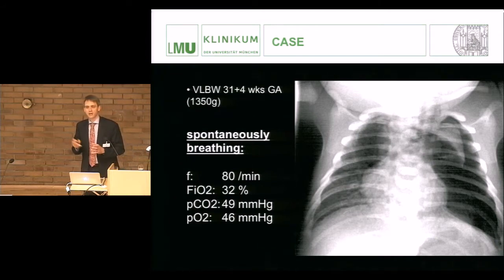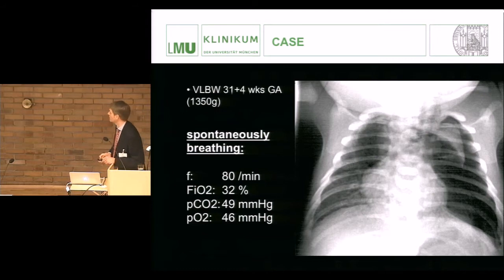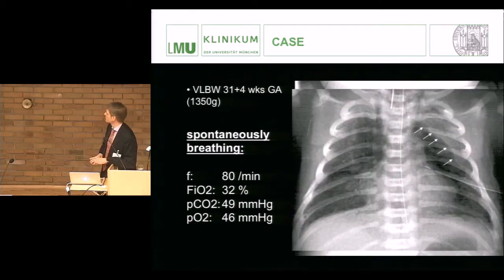So on the one hand, there was the differential diagnosis to have a pneumothorax on the left side. However, if you really look at it very thoroughly, there's no sign of tension pneumothorax. And actually, this is a typical sign of pneumomediastinum, because what you see up here is the thymal gland. Okay, that's the thymus. This is a pneumomediastinum. However, you can barely see it on this X-ray, especially because you can't dim the light, you can see a line down here. So this infant also had a tiny pneumothorax on the left side. So this was drained. However, as you can see, drainage did not solve this problem up here, which was the typical pneumomediastinum. So we are talking about pneumothoraces now.